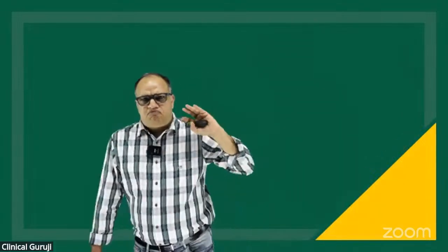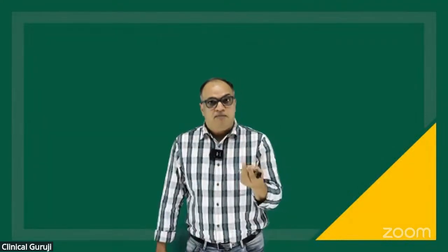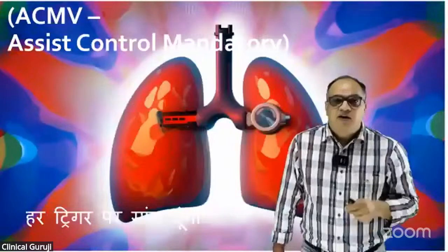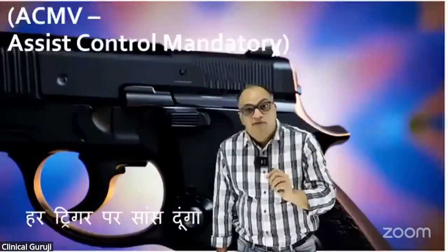So now he was asked to do a different kind of mode. How much air to give, we will tell you. How many times to give, we will tell you. And every time the patient triggers a breath, you will give a full tidal volume breath. This mode was called ACMV or assist controlled mandatory ventilation. The ventilator was supposed to give a breath on every trigger by the patient.